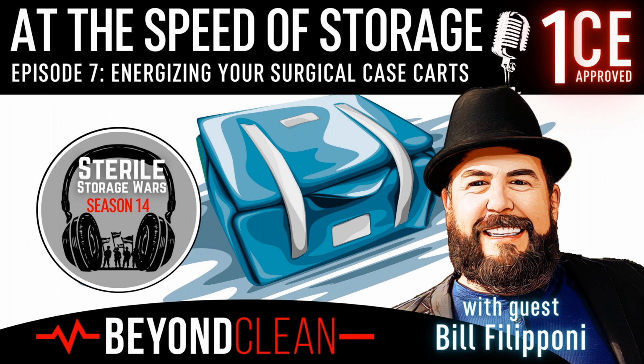Okay, right. So Bill, nobody knows that we're literally in the middle of SPD week as we record this. But when Hank was throwing me under the case cart, he also mentioned the wheels, or casters, I think is how we like to refer to them. Some of them are sealed, some are not sealed. Some get rusty. Stickers get stuck on these case carts. Lots of things happen. They get banged, they get dented. They've got rubber bumpers around the edge in a lot of cases that hit the shoe molding on the walls and all the guards. There are so many things that happen to these case carts over time. Latches and springs break, all kinds of things.